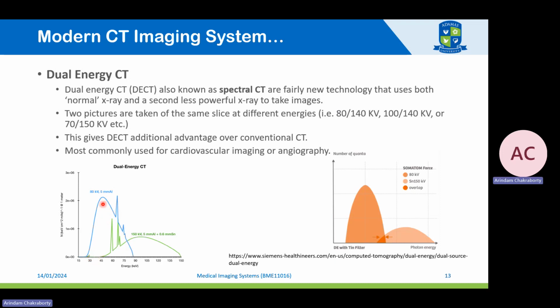An X-ray is generated in the tube in two ways. One is known as Bremsstrahlung, another is the characteristic spectra. So here this continuous one is basically the X-ray that is produced through the Bremsstrahlung mechanism, and these sharp high energy peaks are nothing but the characteristic X-rays.